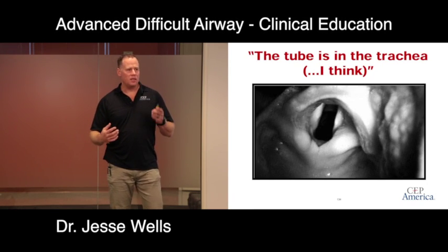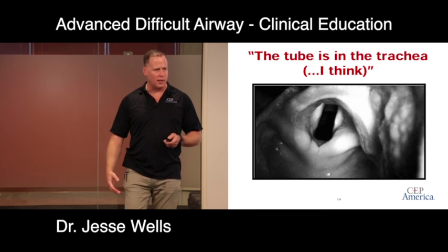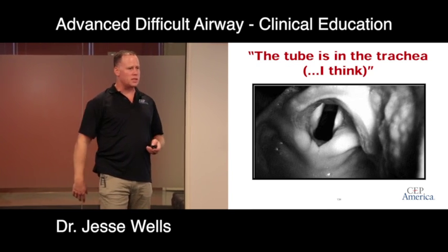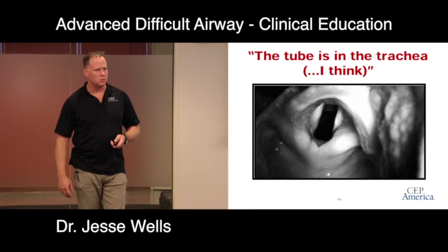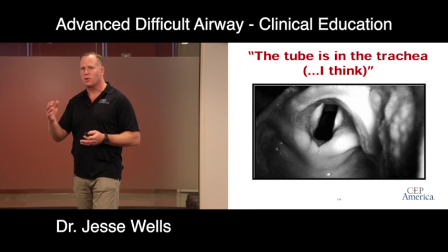So, Letitia, what is the most reliable way to confirm that the tube is in place? End-tidal CO2. What about if you see it go through the cords? That's not better? No? So usually somebody says, what's the best way to confirm it? Well, I saw the tube go through the cords.